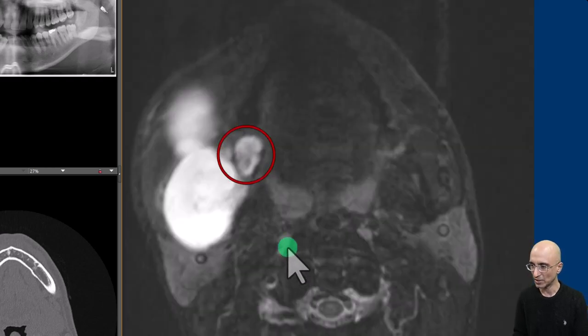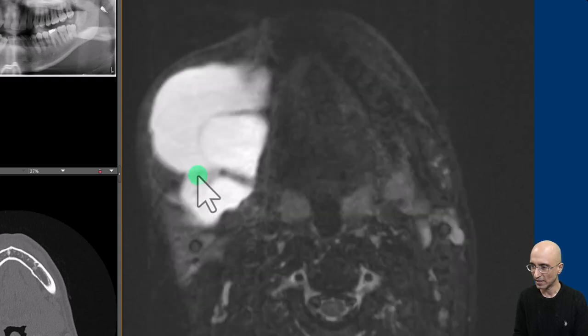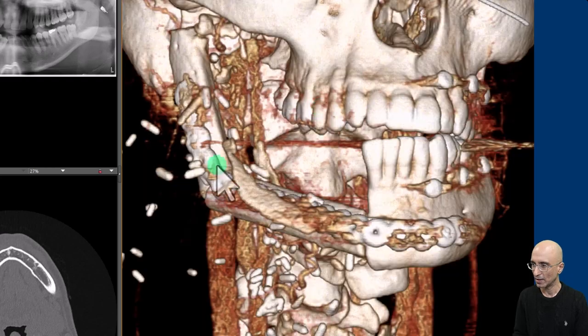On the MRI examination you can see the soft tissue nodule and the multilobulated cystic lesion. The septations can be clearly appreciated.